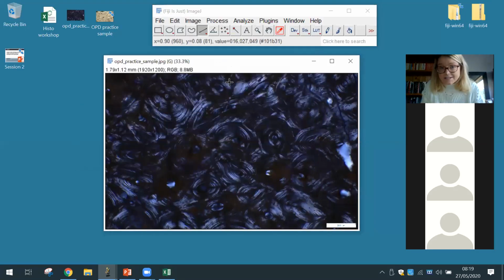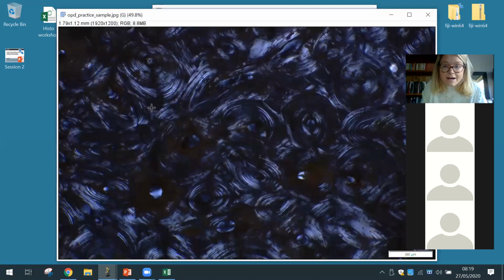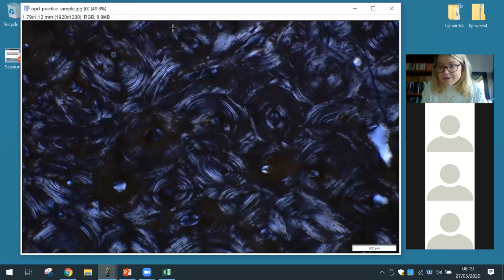All right, let's not save that. Okay, and then let's just count intact osteons. We can do it by clicking on the multi-point tool. So click on that, and then let's just look at them. Typically, I'll spend ages and ages doing this. I'll do an intra-observer error test, and an inter-observer error test to make sure that everyone's on the same page. As you can already imagine, it's quite hard if you haven't really done it before, because you're sort of just working with basic diagrams that show a perfect intact osteon, but then looking at the actual picture of the sample, it can get a bit confusing.